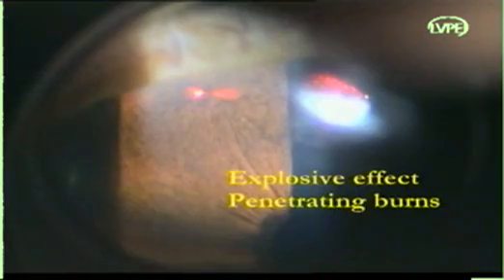The tissue reaction to argon laser varies depending upon the amount of pigmentation. First, place contraction burns at the proposed site of iridotomy to achieve stromal thinning. Then use penetrating burns to chip off the iris stroma. Now, make the opening in the iris using 1 or 2 shots of ND-YAG laser.